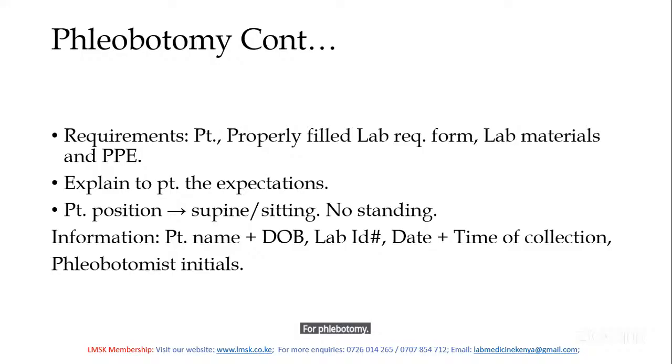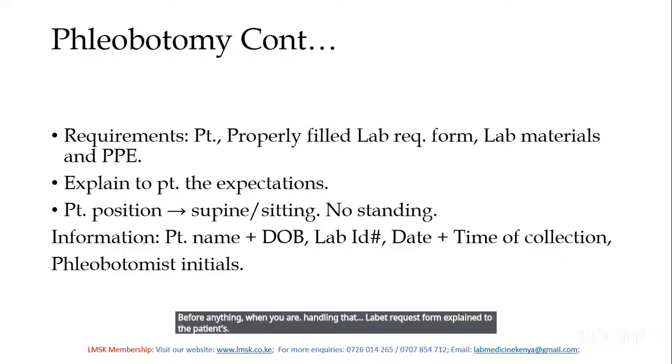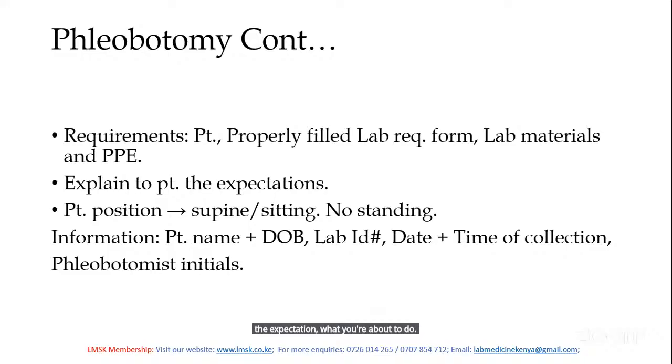Now, it is recommended that you explain to the patient before taking blood, when you are handling that laboratory request form, explain to the patient the expectation, what you are about to do. Greet the patient, then for instance, you can tell the patient that the clinician has sent you here so that we collect blood for some tests.